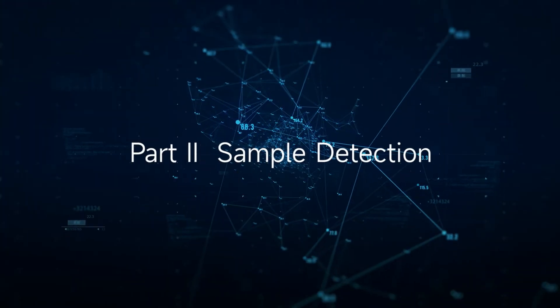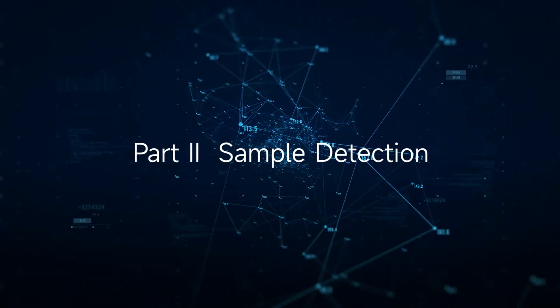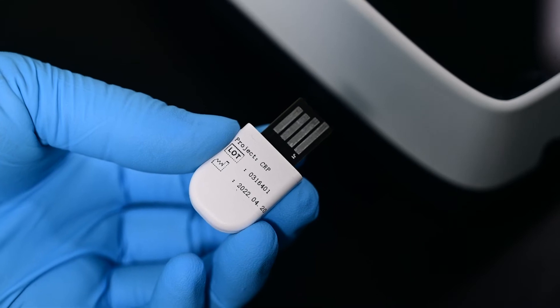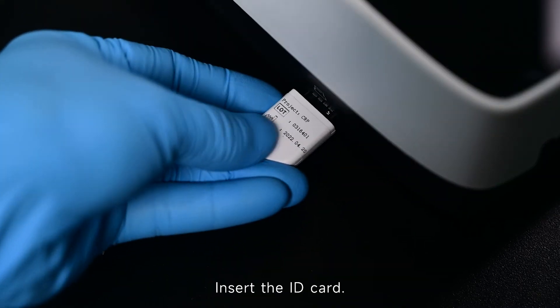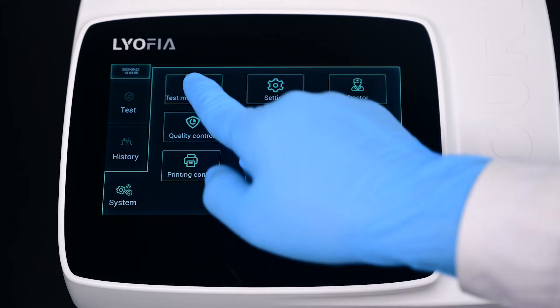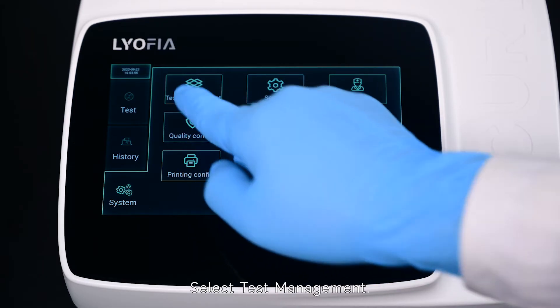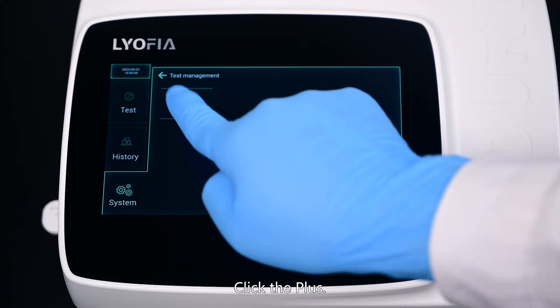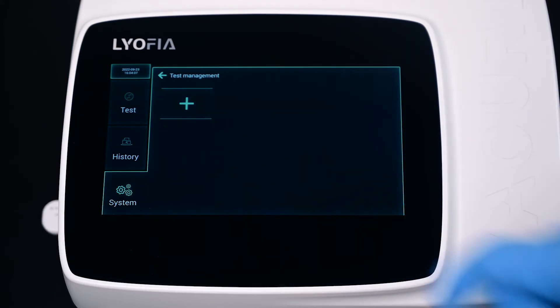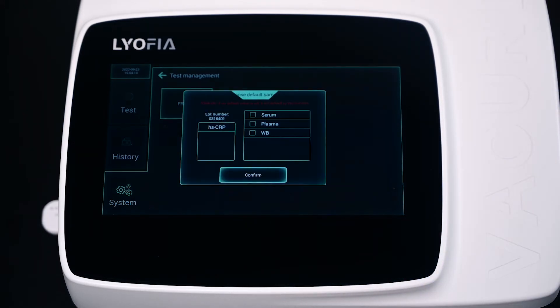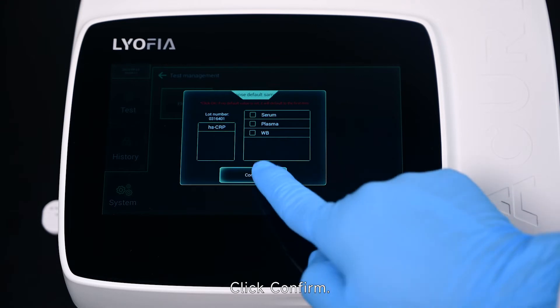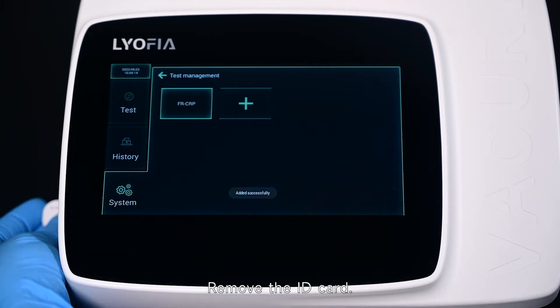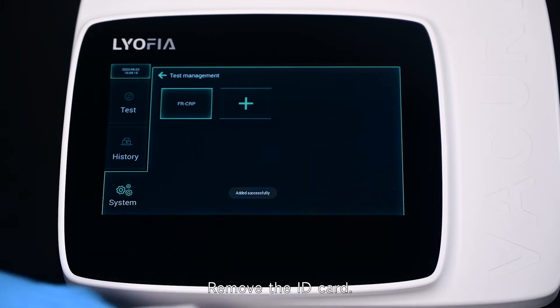Part 2: Sample Detection. Insert the ID card and select Test Management. Click the plus button, then click Confirm. Added successfully. Remove the ID card.